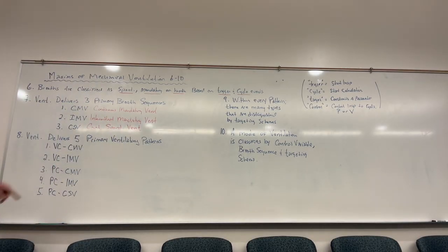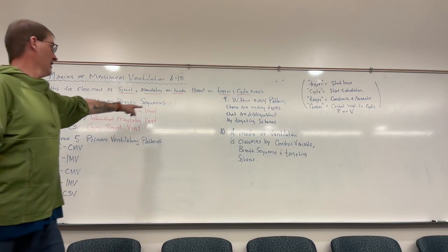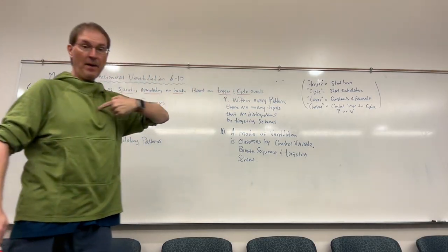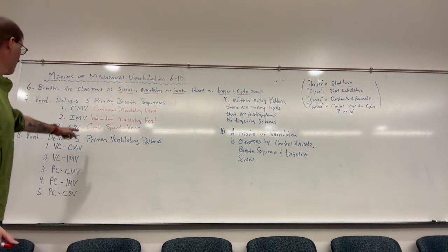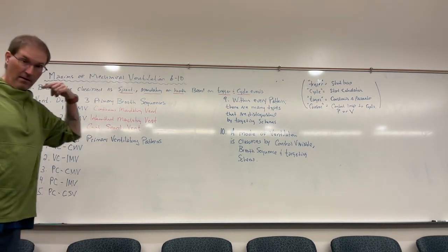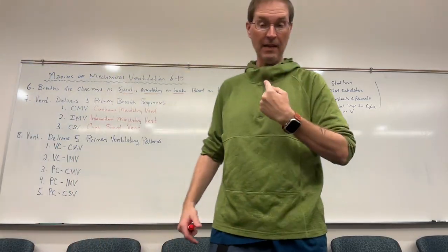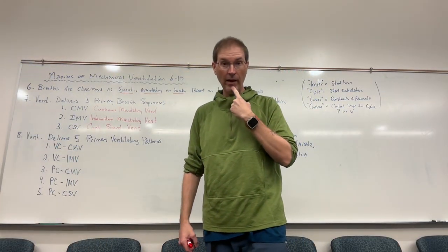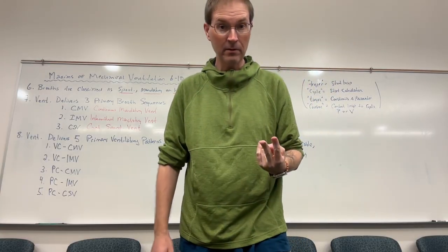And this is where every breath the patient takes is triggered and cycled by the patient. All right. And so every breath is spontaneous. The breaths are still mechanically ventilated because, again, there has to be an artificial airway in place and the ventilator is delivering positive pressure support, right?